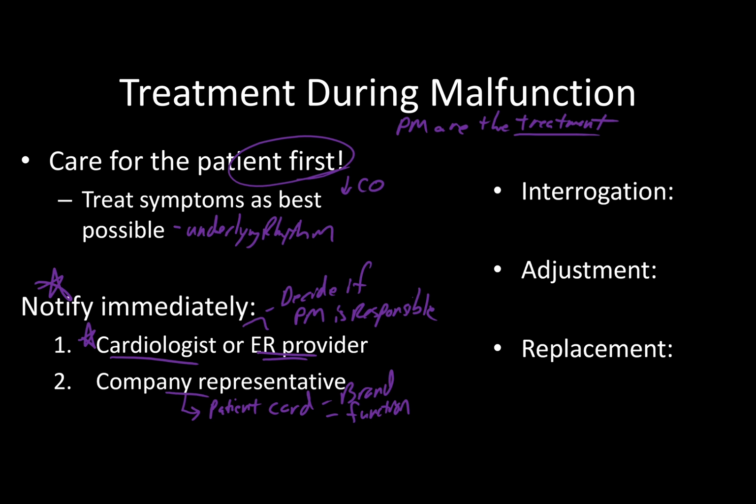just presented unconscious and you're just trying to do what you can, check out the EMR. That's an excellent source. Or an excellent record of the device, especially if it was placed in your facility. In those cases, the cath labs and places that do this will put in all the information you need to figure out what type of device it is and who to contact in order to expedite things.